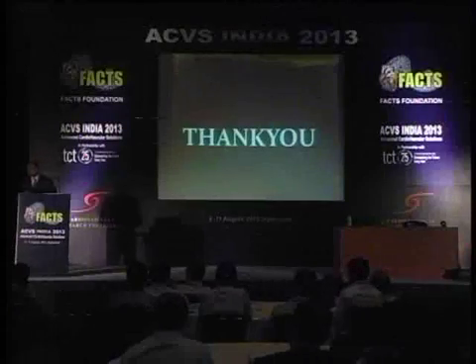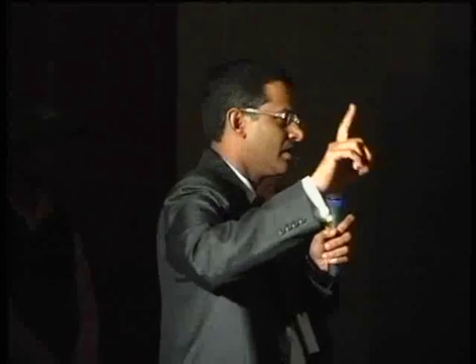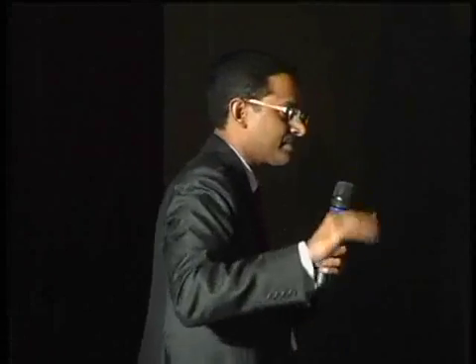Can I add something to that? Actually, left main is so roomy, close to the aorta, the pressures are so high, and the stent size is so big. The least thrombosis chance that you see is generally in left main. We are very scared that left main is going to thrombose. But actually, if you have done a good job, the least thrombosis that happens in any stent is the left main stent. Even the distal left main bifurcation? Yeah, see, a complex case if you do, but it's a single stent strategy, yes.